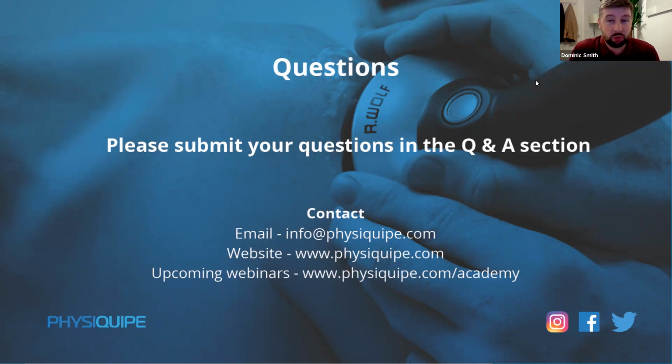I think it's what you deem as clinically appropriate. I've treated pregnant women before, and it's always been with manual techniques, exercise rehabilitation, and that kind of thing. The only time I've done a treatment with another device was with a lymphatic drainage device that we have, on ankles, because she basically twisted. It wasn't swollen ankles from the pregnancy. She actually just twisted her ankle. First trimester, that was the only one that I've used. Yeah.